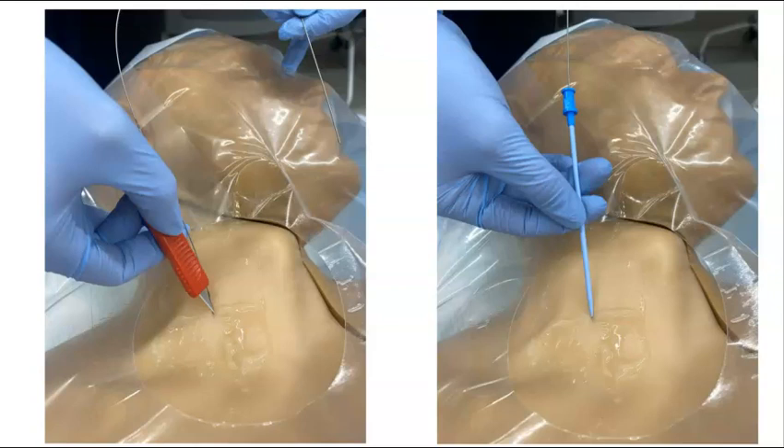In order to get the central venous catheter through the skin and subcutaneous tissue, you must now dilate the skin. This is done by making a nick in the skin using a scalpel — hold the sharp portion away from the guide wire and then make a nick in the skin. Subsequently, place the blue dilator over the guide wire and into the subcutaneous tissue. Usually, entering until about half of the dilator remains is adequate. The dilator is then removed while the guide wire is carefully kept in place at all times.